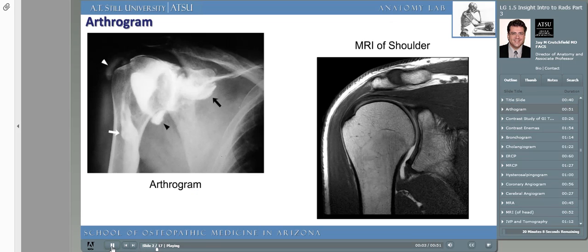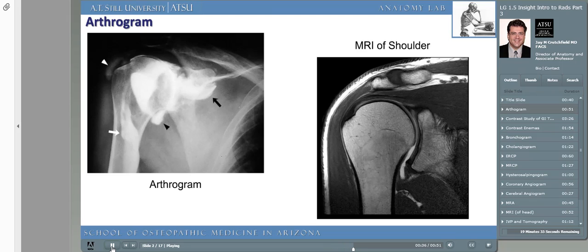Here's an example of an arthrogram, which has almost been replaced today by the MRI scan. An arthrogram can be used on just about any joint of the human body. The radiograph is obtained by inserting a needle directly into the bursa and injecting iodinated contrast — an iodine-containing chemical. It carries the risk of being painful and possibly causing an infection in the joint space. If there is a tear or injury to the joint, contrast may be seen leaking outside of the joint capsule. The test is most commonly used on the shoulder or knee, but is rarely performed today, as MRI imaging has mostly replaced arthrography.